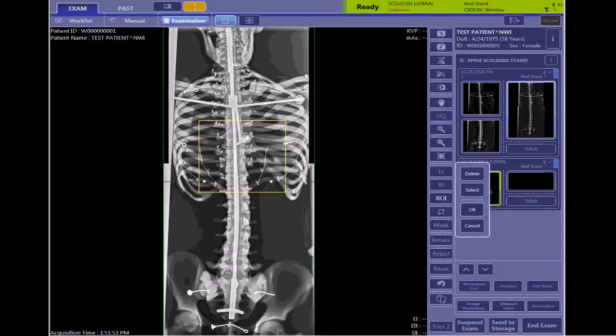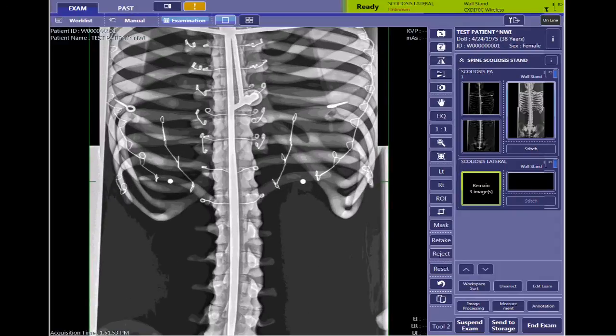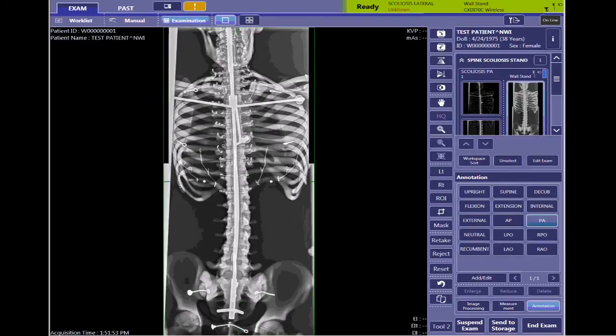At this point, I can do any and all editing that I do on normal images. I can do the ROI, adjust the cropping if needed, masking if needed. If I need to check to see if it's stitched correctly, I can magnify it to double-check that yes, my BBs do overlap. Remember that you do want to reset the size before you send it to PACS. Make sure everything is labeled the way you want, and then when you're finished, click End Exam to send it to PACS.